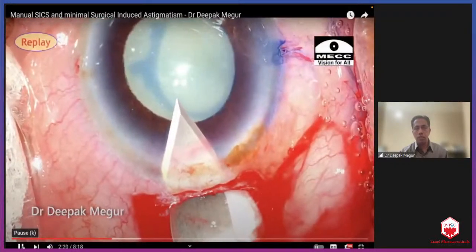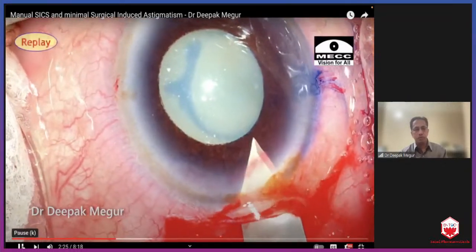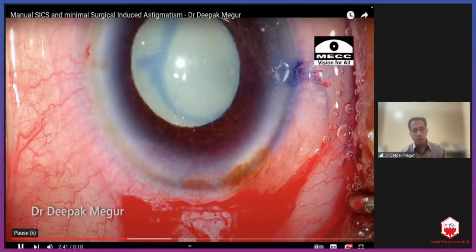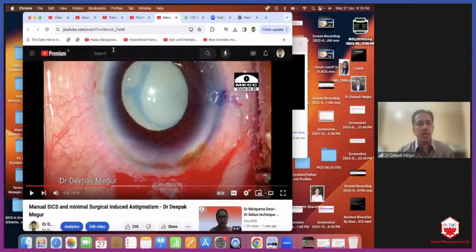A lot of attention needs to be given to the way we construct the scleral corneal tunnels. And the sad part is the internal incision is always ignored. We need to have this biconcave pattern of both the external and the internal incisions with respect to the limbus, which ensures greater stability of the wound, which results in long-term refractive stability. So, as Dr. Anisha had shown, there are multiple variations, but I believe that this variation where you have the inner lip always parallel to the limbus really adds a lot of security to the wound.